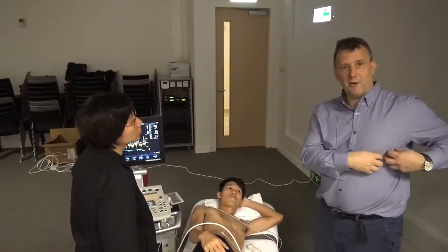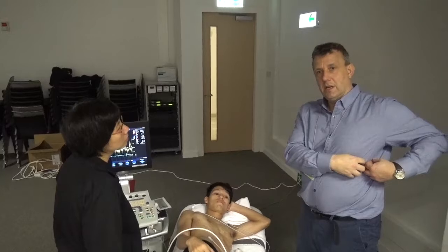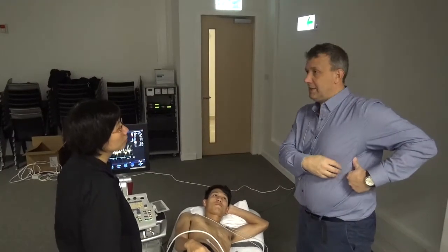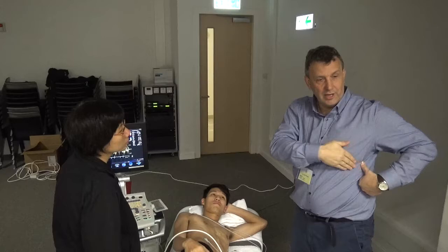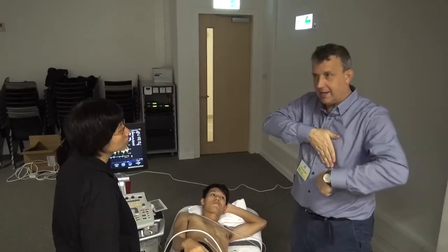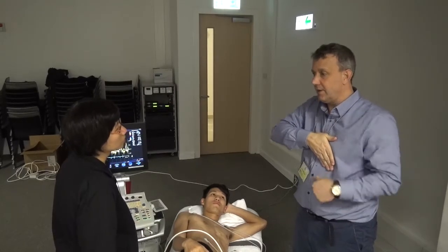Some people you have to go all the way round, almost under their armpit to get the orientation. If the heart's sitting like that, you've got to get round there. If the heart's sitting like that, you're out in the chest wall over here.